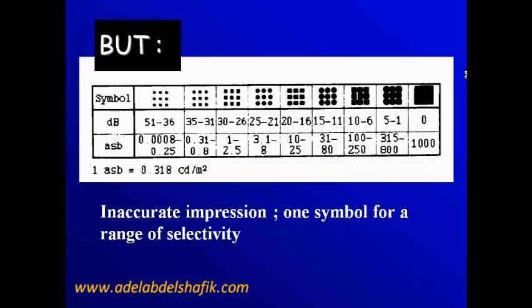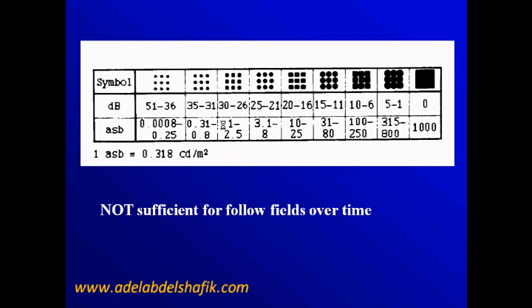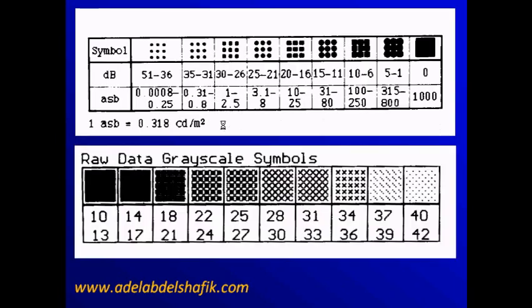Each symbol covers a certain range — for example, a symbol may be used when the sensitivity is between 26 to 30. Over time, if you repeat the same test for the patient, the sensitivity of the area may change but the computer is still using the same symbol. Also, different machines use different ranges for the same symbol. So we shouldn't depend on this area at all.